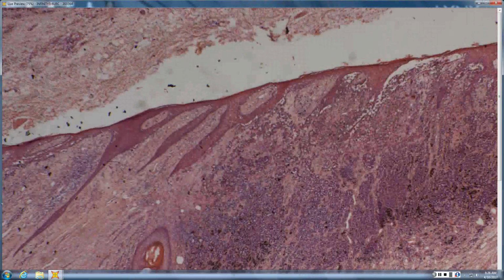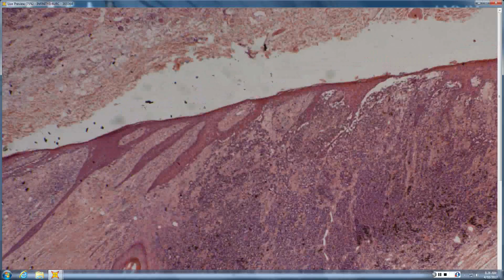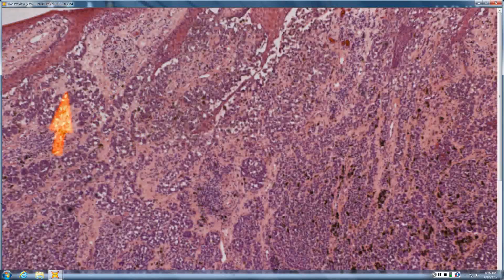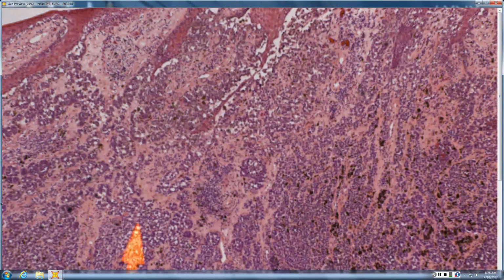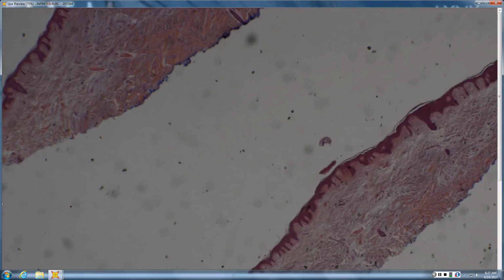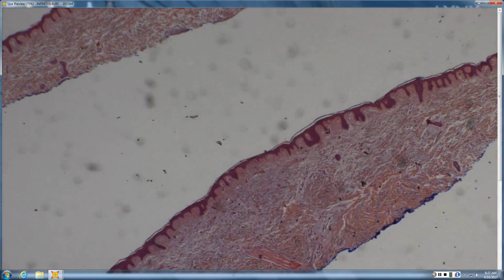That part looks like a melanocytic proliferation. Looks like melanocytic proliferation. It's pretty evil from this height. Is it just tips and sides of rete, or is it up in the arches? Oh, it's all up in there, up in the arches. And melanoma, yeah, exactly, which is what that is. Big, broad. So trabecular pattern, which trabecular or parallel goes with melanoma, including nevoid.